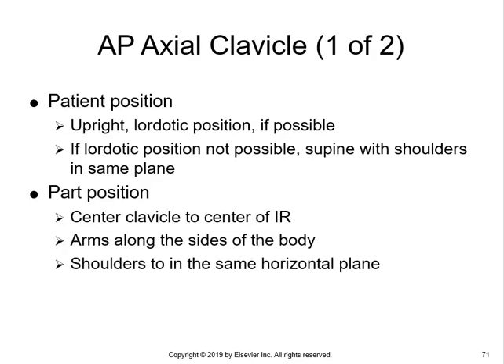So since we can't get 90 degrees from that, what we're going to have to do is just get a different view that would show us some degree of three-dimensionality. So we can diagnose exactly where the displacement is in the event that we have a displaced fracture.